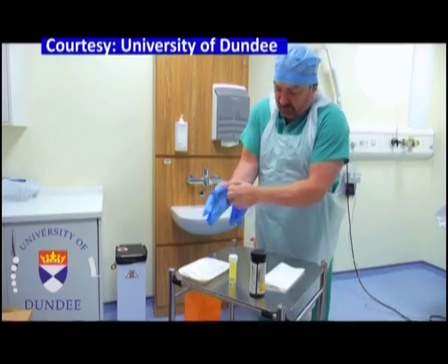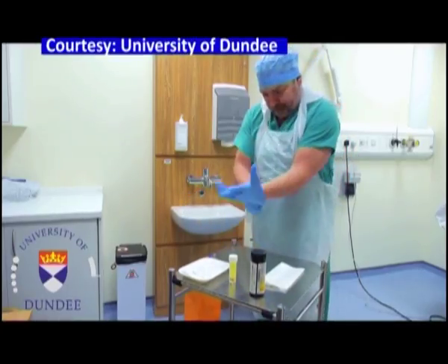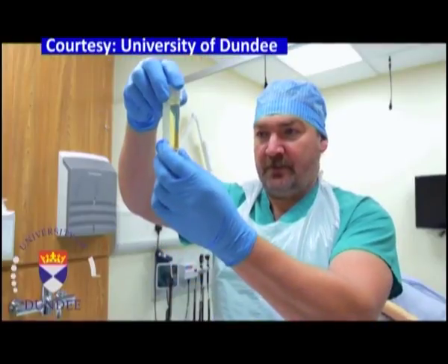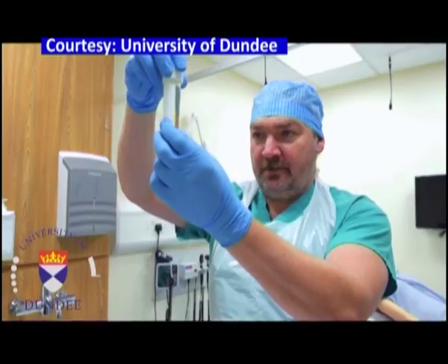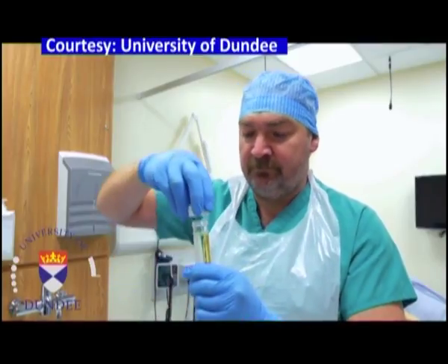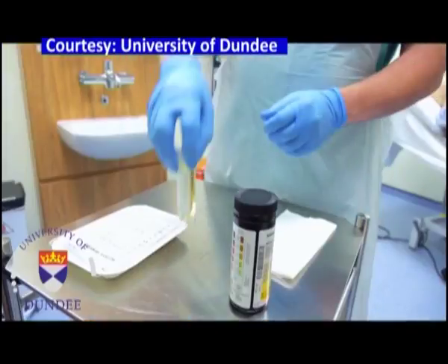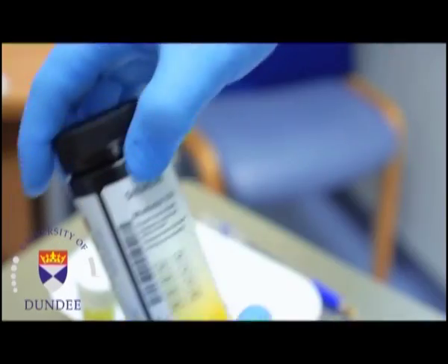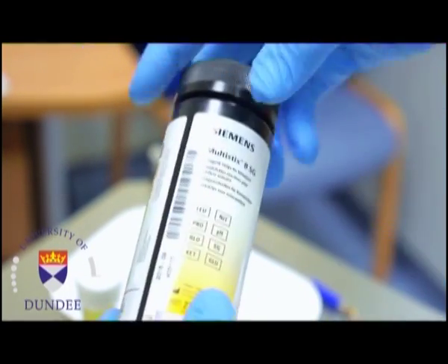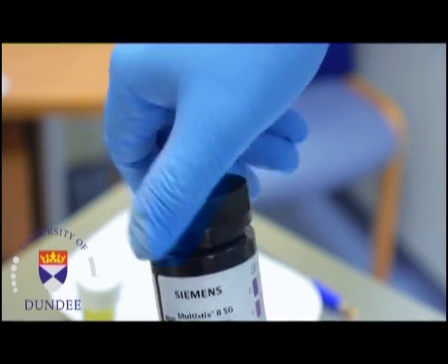Now, the visual examination. During the visual examination of the urine, the laboratorian observes the urine's color and clarity. These can be signs of what substances may be present in the urine. They are interpreted in conjunction with results obtained during the chemical and microscopic examinations to confirm what substances are present.